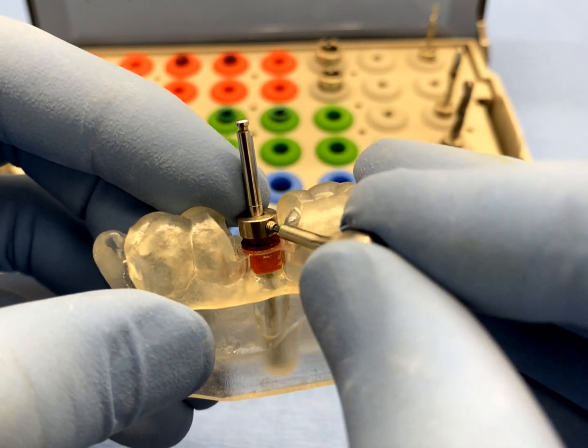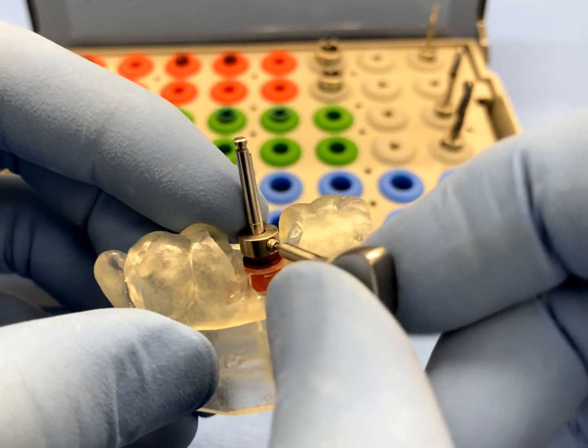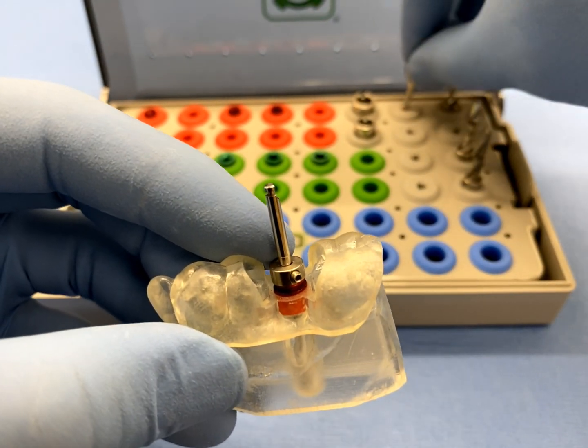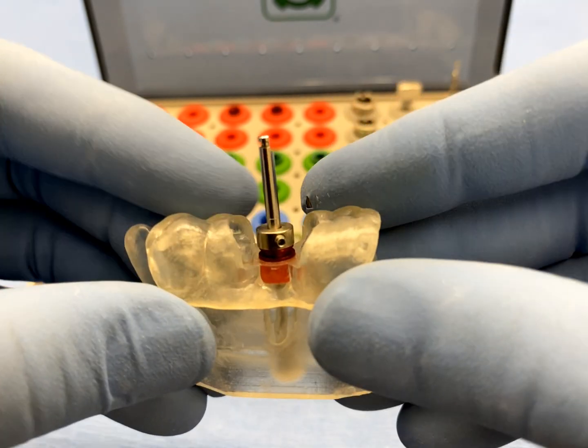Once complete insertion has been confirmed, firmly tighten the set screw of the GRS drill stop with the GRS drill stop driver.